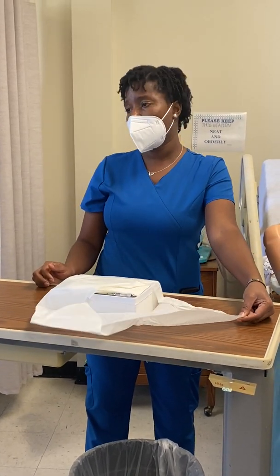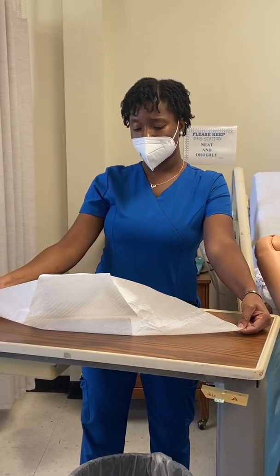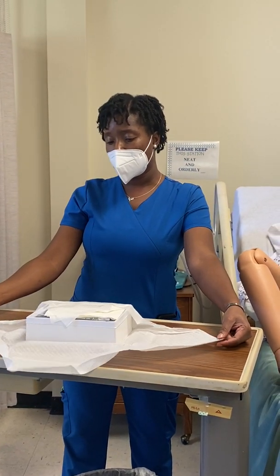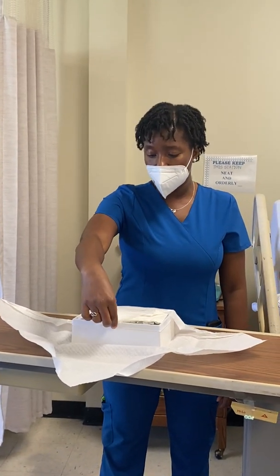And I can be within my what? 1 inch border. Okay? And then I'm going to get this side and I'm going to tug at it. Now, are these flaps going to always stay back like I really want them to do? No, they're not. Okay? And when that happens, I'm going to show you what you can do.